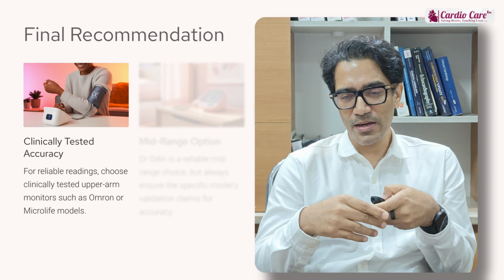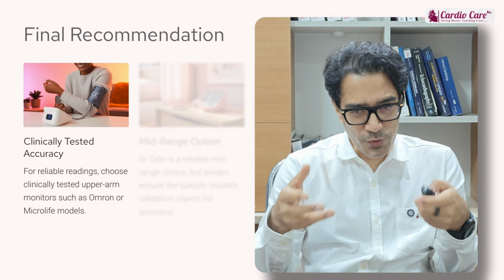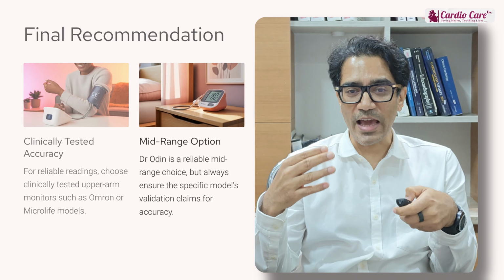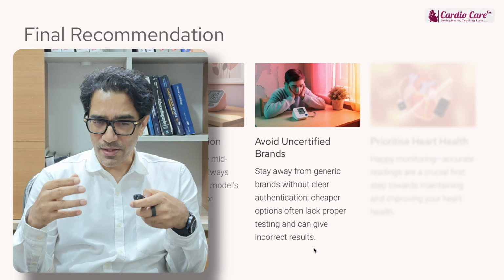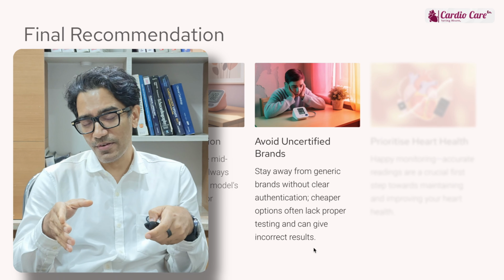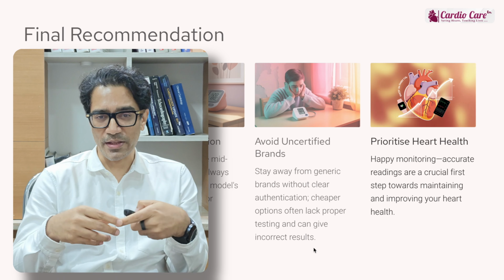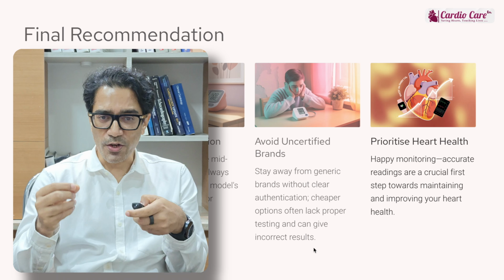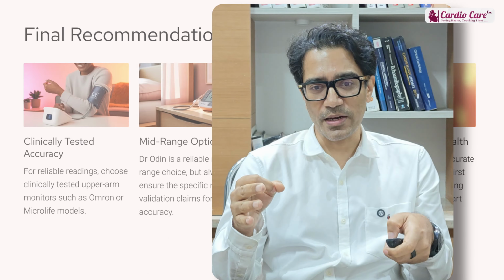So ultimately the final recommendation would be you can use a digital monitor at home, because using a Mercury based monitor at home might not be suitable, but look for validation. Check whether these certifications are there or not, and you need to calibrate it with the clinic Mercury machine every 6 monthly. Do not go for cheap alternative options of digital monitors available in the market, because these cheap uncertified devices may not give you a correct BP reading. You should invest in your health, and blood pressure is a very important aspect, because hypertension is a silent killer. So you need to have a good BP monitoring device at home. Even if it is a digital one, go for a good device.